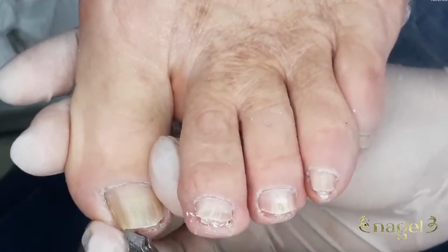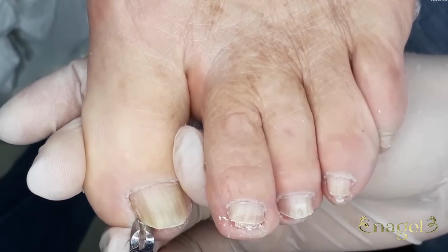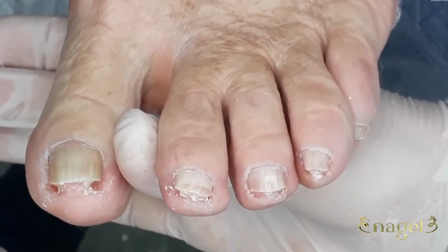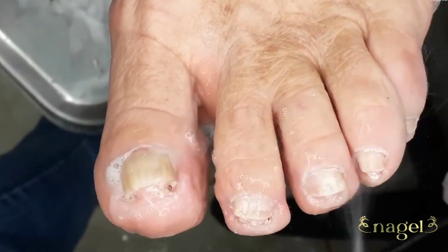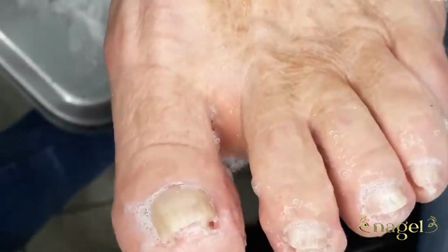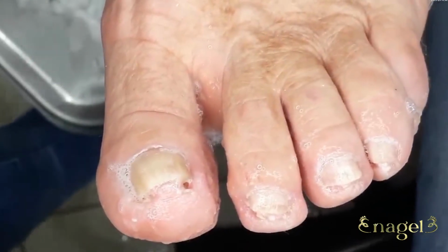After filing, I use a low-speed drill for a deeper cleaning. With the drill, I remove superficial fungal layers and smooth the nail surface. This is important not only for aesthetics, but because a thinner nail allows the antifungal to penetrate better.